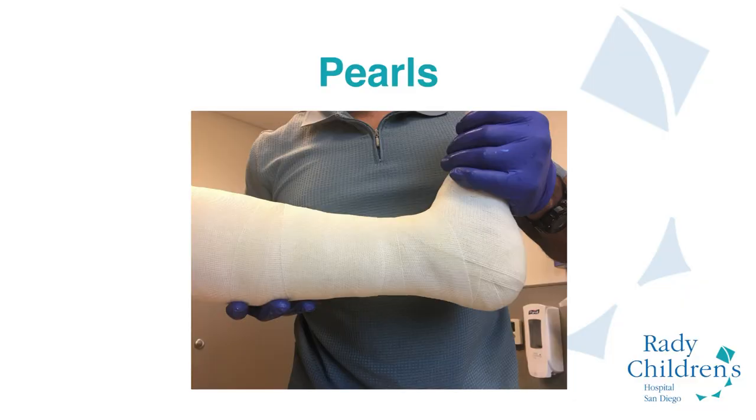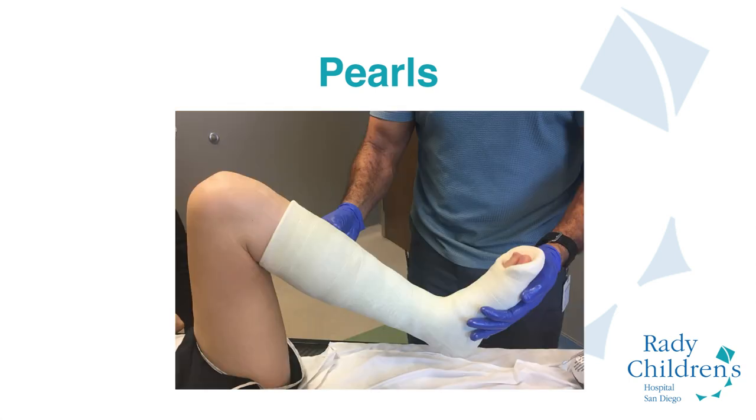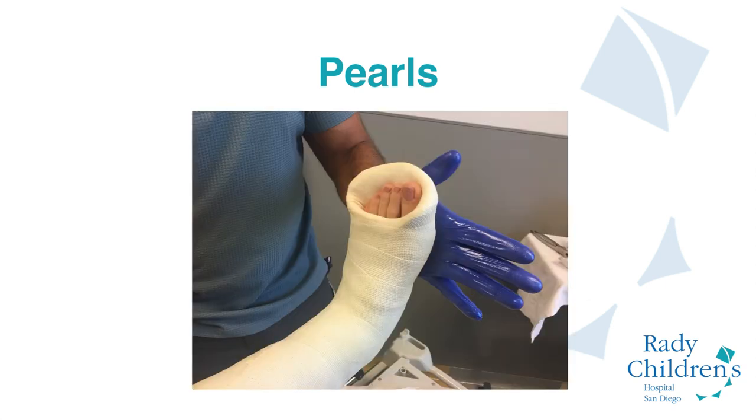Your final product should show a nice contour following the Achilles on the back of the heel with no wrinkles either in the back or anteriorly. The oblique nature of the cast proximally allows the patient to bend their knee so they can walk and go up and down stairs. In the last image, you can see how the toes are visible to check for swelling, but also protected so that when walking, they're not dangling off the edge of the cast.